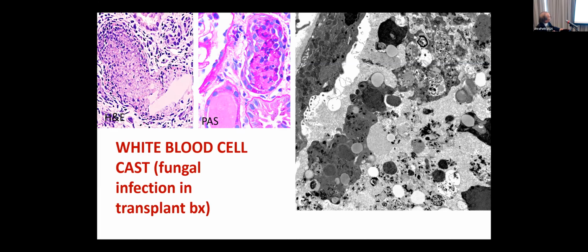I suppose there is another one here with also a pure uromodulin cast for comparison. When you do electron microscopy, typically there are fragmented neutrophils, as you can see here, but interestingly there's a background here. This background is composed of pale, fibrillary material, typical for uromodulin deposition.